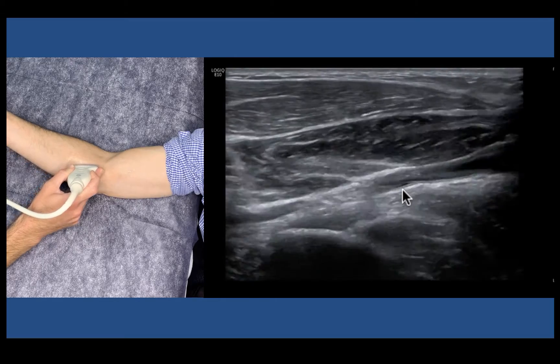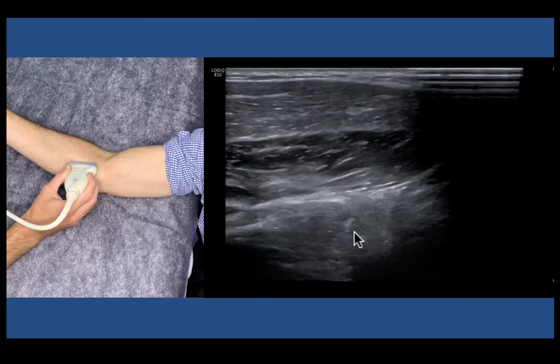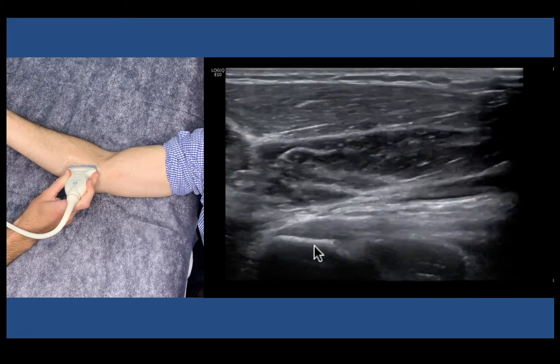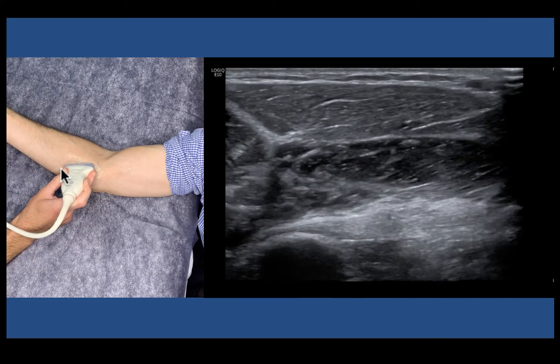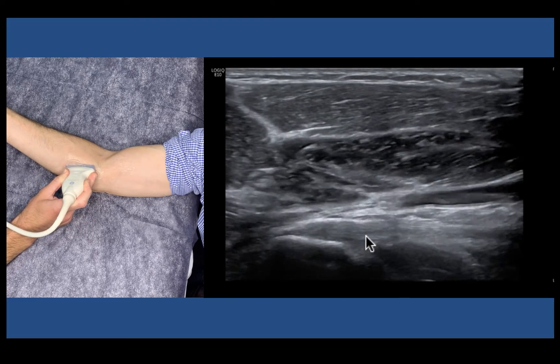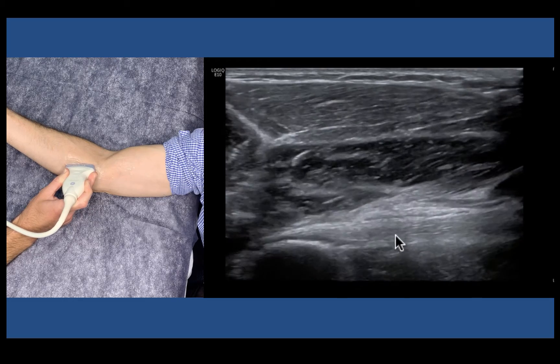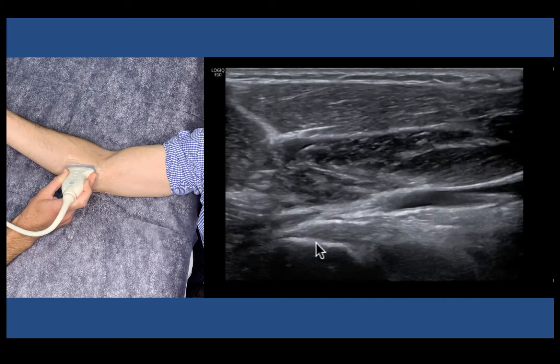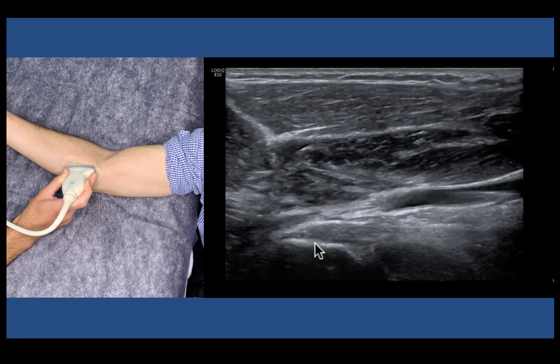To improve our view we're going to bend the patient's elbow up and add a little bit of active flexion. This puts our tendon a little bit flatter on the screen and puts it on a bit more tone. Then we're going to really dig the thumb end of our probe in through here — dig the distal end in to heel-toe and get that tendon nice and flat. Then we can start to differentiate the two heads of biceps. We can see our short head that plugs in here and fans towards the floor, and we can see the long head of biceps as it plugs in through here.